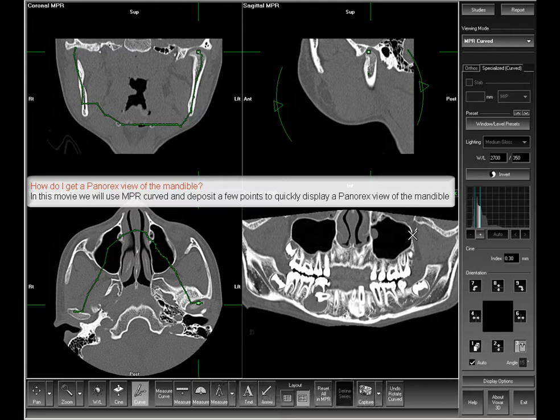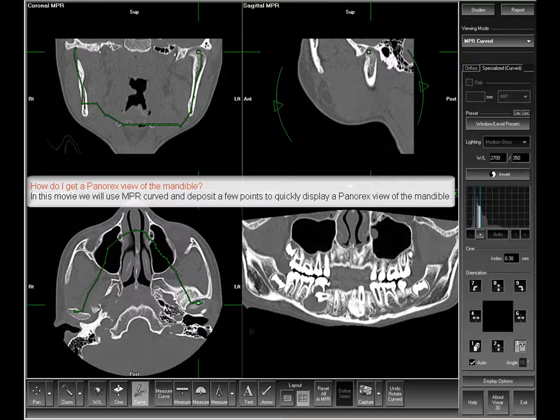How do I get a panorex view of the mandible? In this movie, we will use MPR curved mode and deposit a few points to quickly display a panorex view of the mandible.